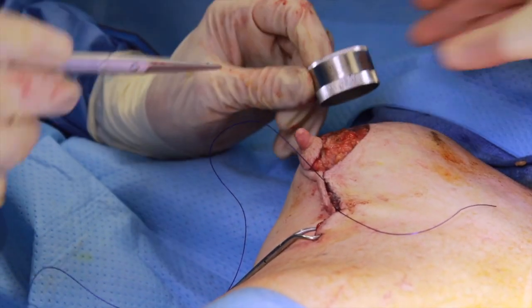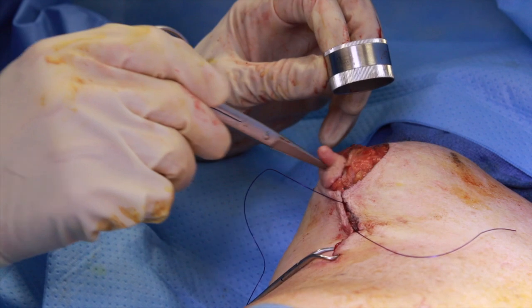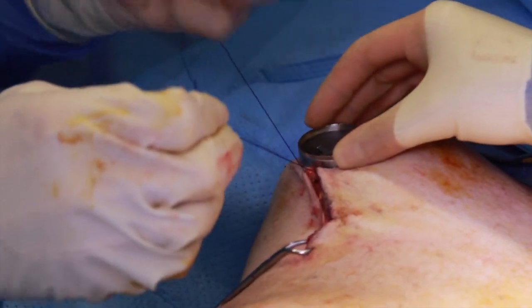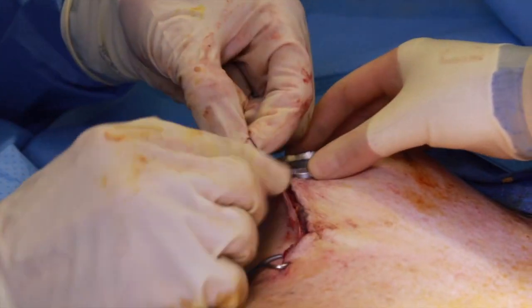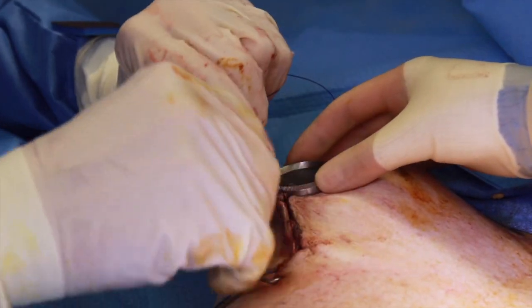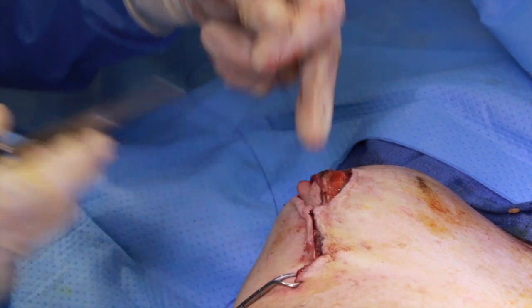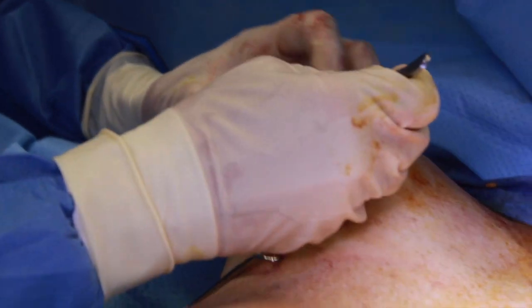As you can see, we've pulled the flaps together here, and the opening that we have for the areola is way, way bigger than the areola. So we put a purse string suture around here and we're going to tie this to the size of our smallest little template, which is 38 millimeters. Once we've tied this, that'll hold the skin in a smaller hole. It'll leave some puckers around the edges, but as the months go by those puckers smooth out. This way we'll have a closure without a whole lot of tension on the areola.